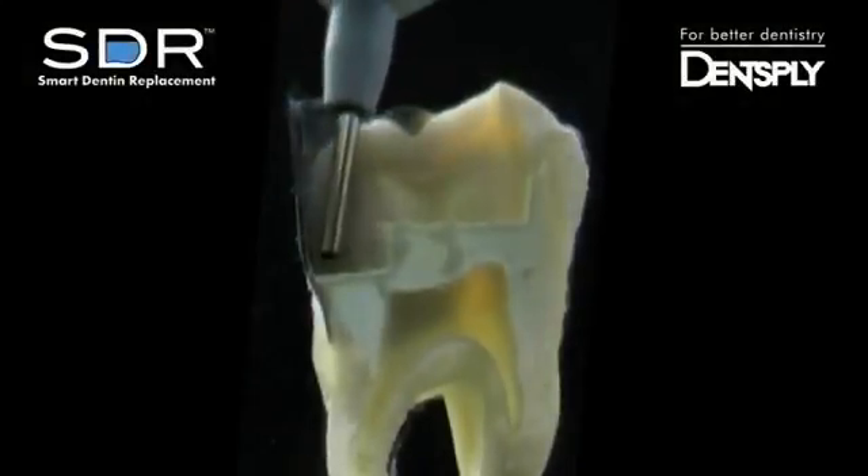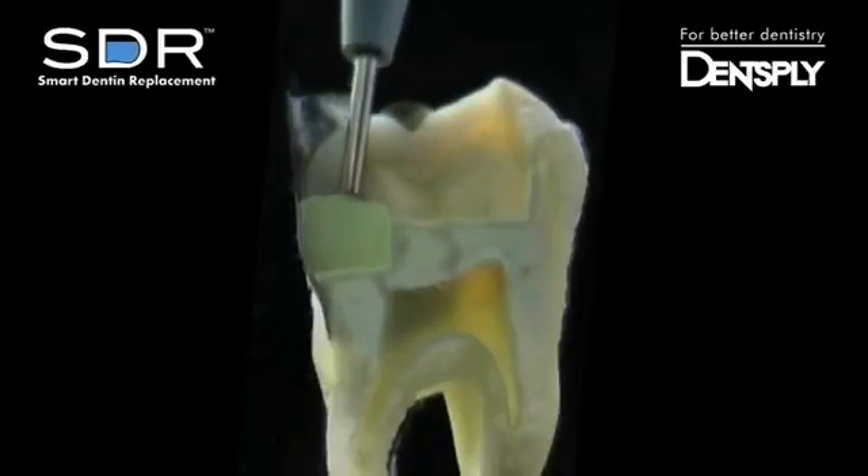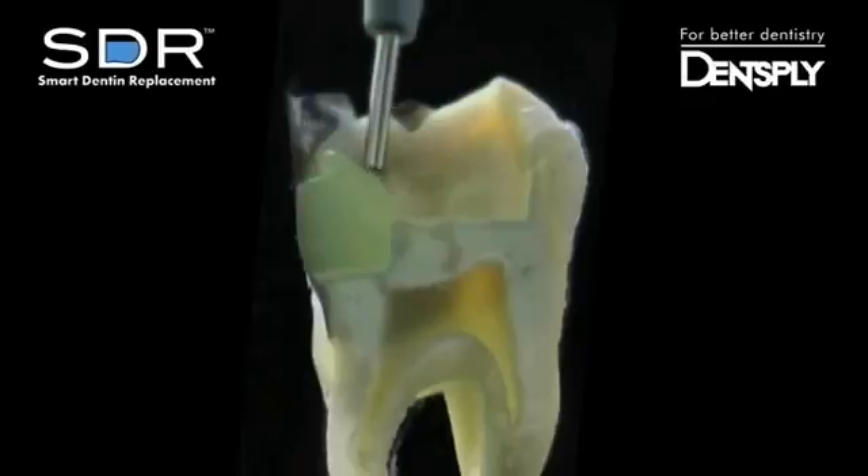Begin dispensing at the deepest part of the proximal box. SDR not only adapts to the matrix band, but to the internal anatomy, including the sharp corner of the proximal box.